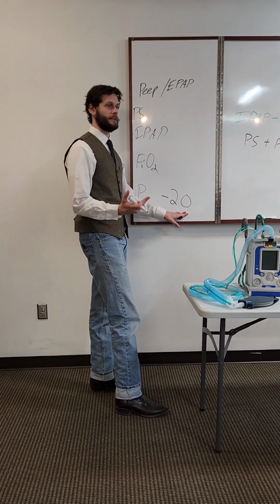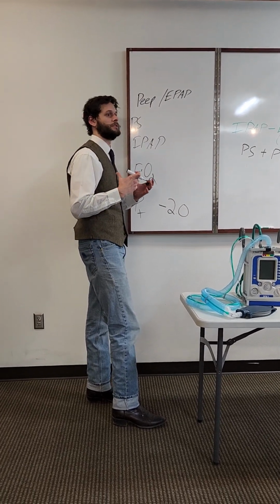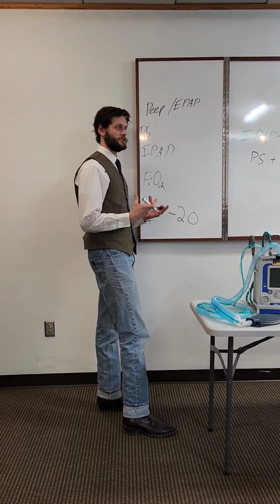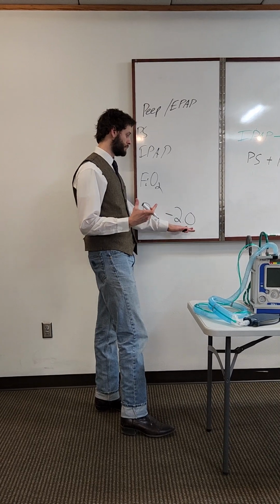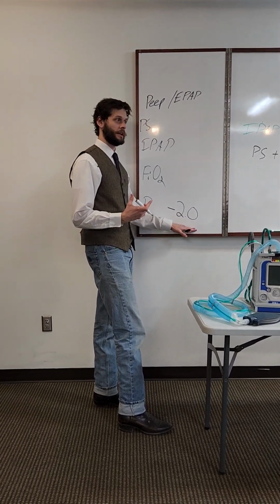Exactly. They're already in a disease process. Maybe their lungs are so swollen up, or it's obviously something's not working right. They're not breathing as they should be. They need help. So then putting them at -2 pressure is just too far, but it's always going to start at that.